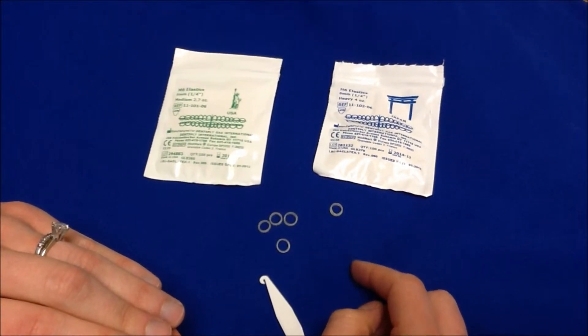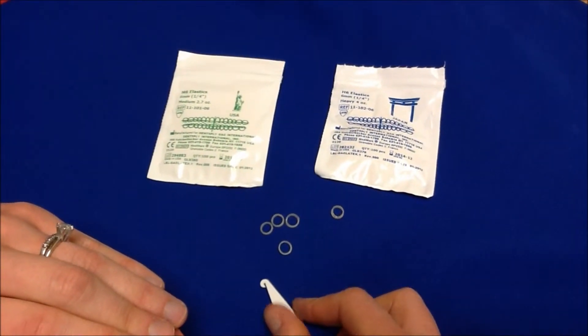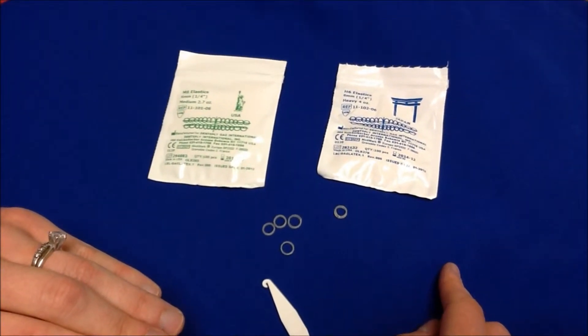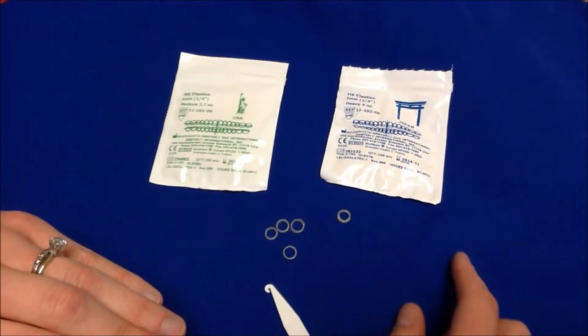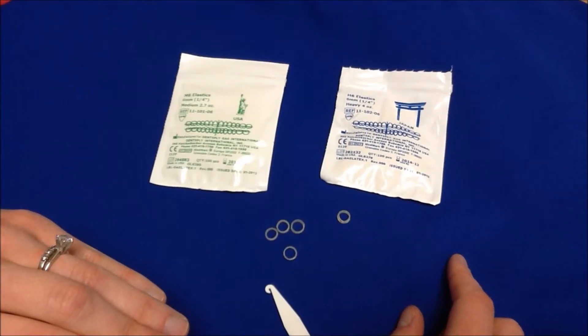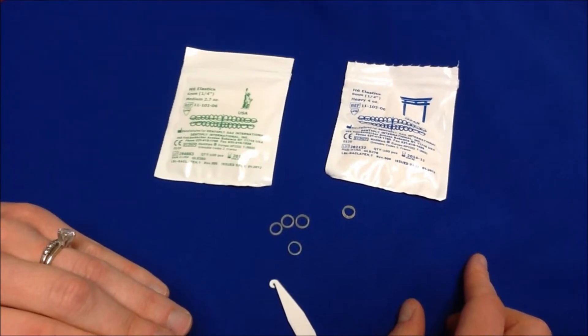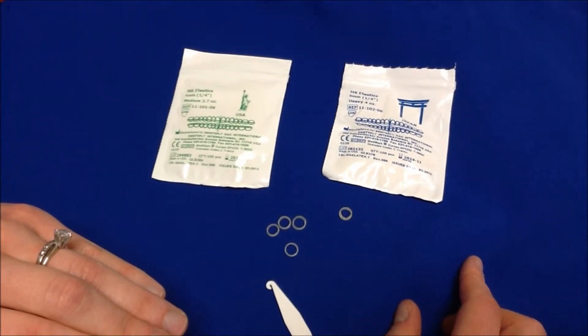This video is about wearing elastics, or rubber bands. When you get your elastics, make sure to pay attention to what the bag looks like — is it green, is it blue, latex, or non-latex? When you need more rubber bands, you'll be able to quickly and easily get a pack from any of our staff if you remember what kind of rubber bands you're wearing.